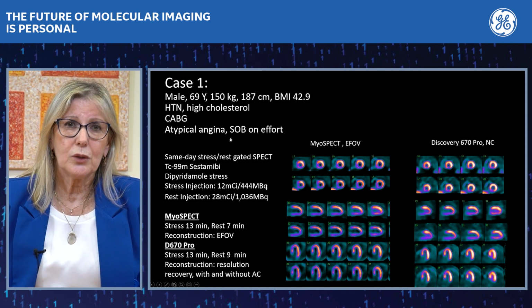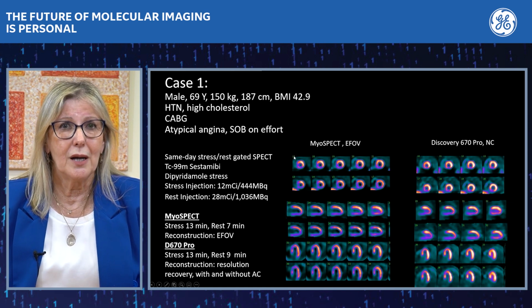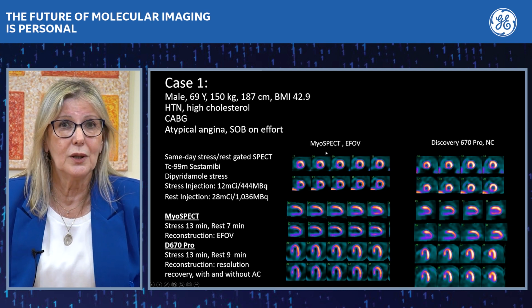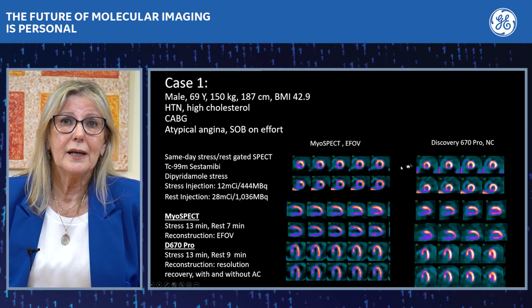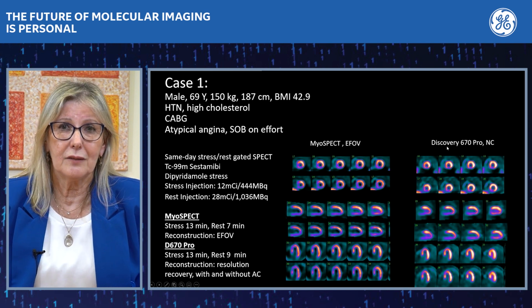The patient was recruited to our study comparing imaging with MyoSpect using the extended field of view option and the standard conventional camera, the Discovery 670 camera.